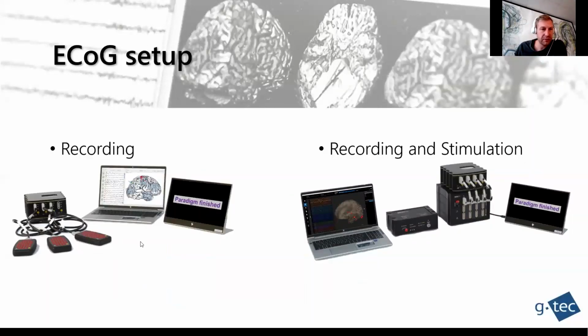And the complete system looks like this. For recording only, we have the head box with the connection cable to the amplifier, and the processing PC with the software CortiQ running to show the raw data and the brain activation by means of bubbles. And a patient monitor is also usually mandatory to instruct the patient on the task, or to present, for example, visual stimuli to the patient.